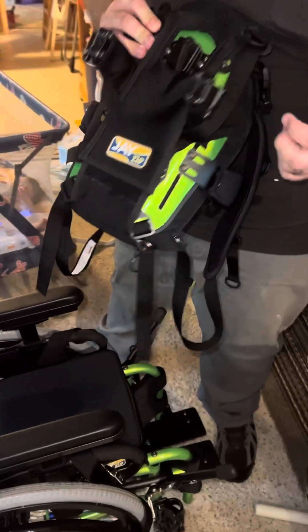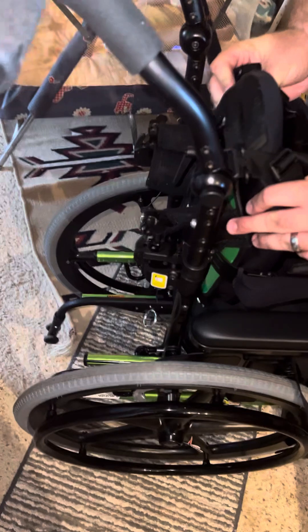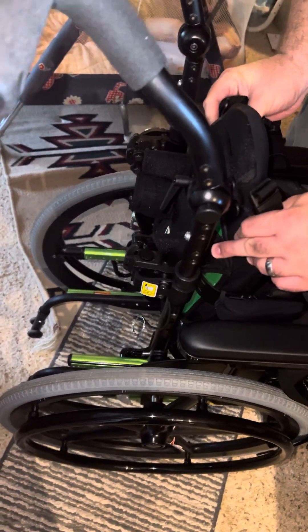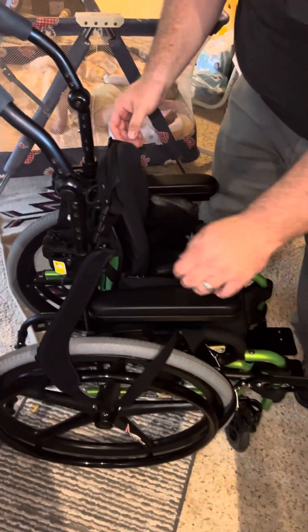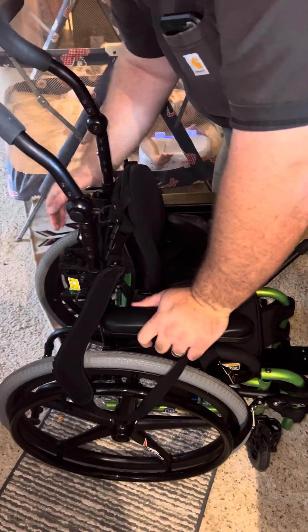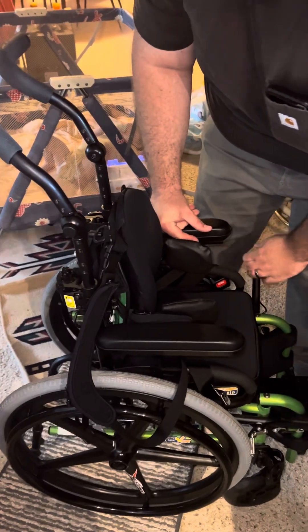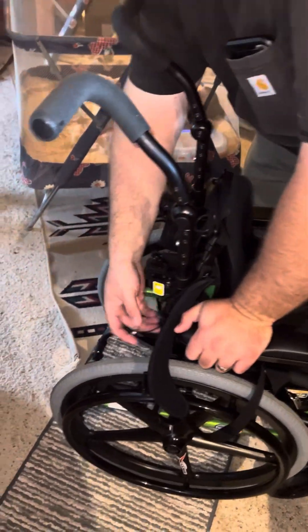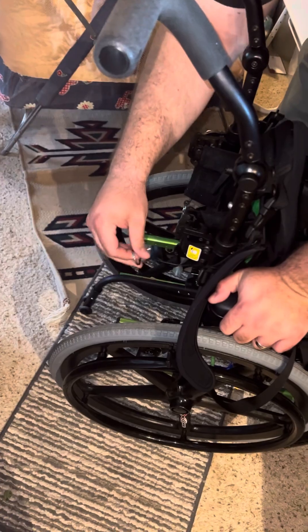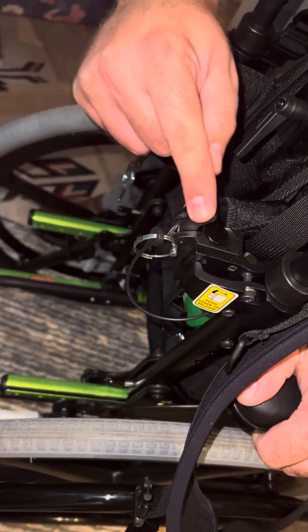This has these little points on it that go in these holes — and it just sits in and locks. Then it's good to use. You can unlock the wheels and it's ready to go. If you really want it secure, there's a pin on each side that goes through this hole right here, and then these won't open.